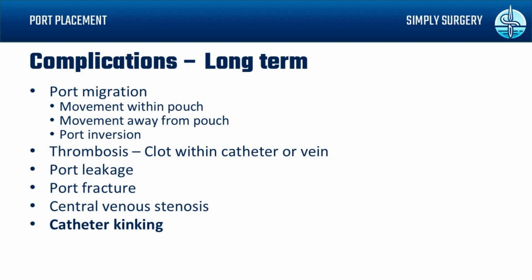Finally, the catheter leading from the port to the vein can kink, blocking the ability to administer medication and making the port inoperable. Well, as someone unfortunate enough to have had a port for a couple of years, I can tell you the migration complication is definitely real.